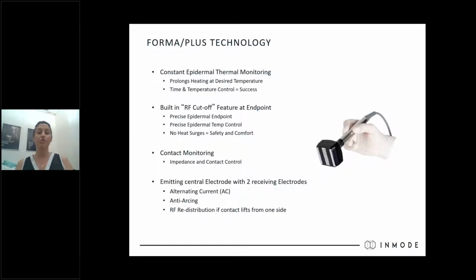Unfortunately today with the hands-on part, normally I do show that. Unfortunately today with our patient of the day, the only sound you'll be able to hear is that bad contact, bad coupling sound, and you will not be able to hear the actual audible signal with regards to the temperature, but you'll be able to play with your hand, with the applicators in your offices, and see and hear that as well. So this is what we've talked about with the bipolar RF.